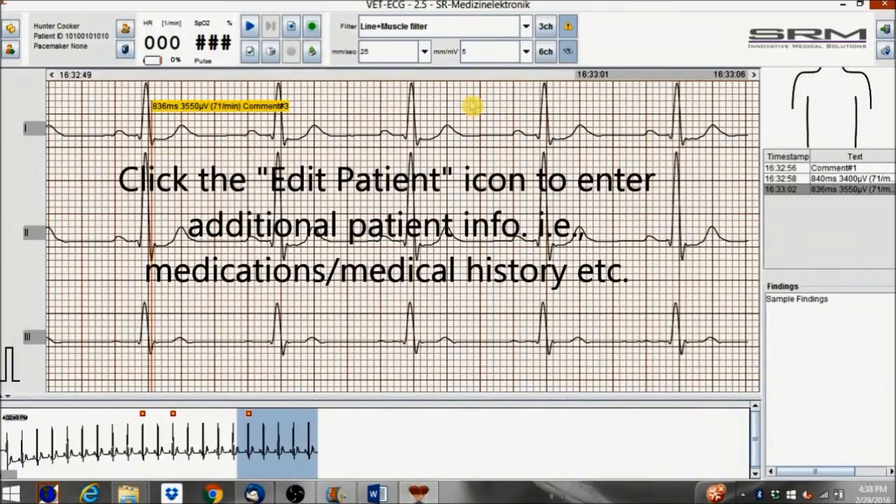Click the edit patient icon to enter additional patient info, for example medications, medical history, etc.